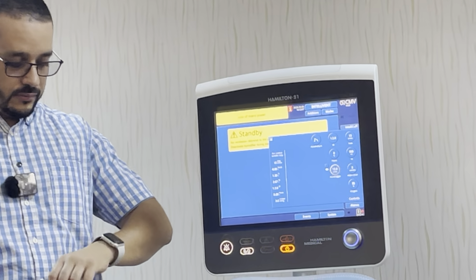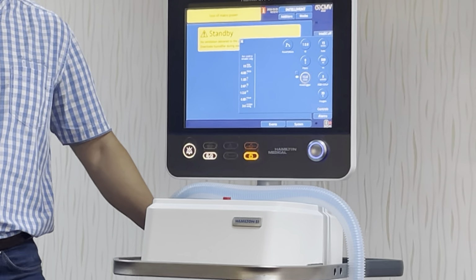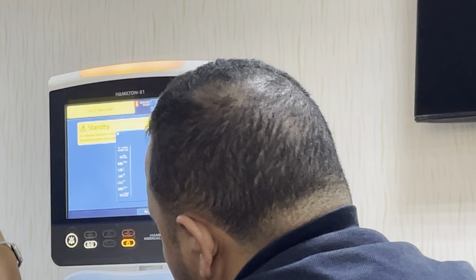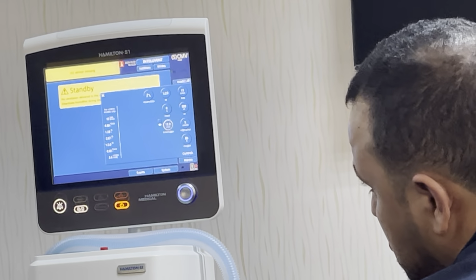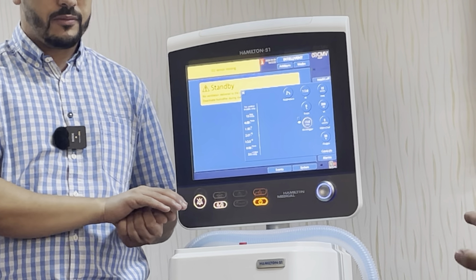Is it going to support the start of the breath, or will it let him take his breath and then support? Every time, the main reason of the support is to decrease the work of breathing. So there is no need to let the patient make a high effort in order to breathe. The machine will detect and support immediately with pressure or volume, and start the ventilation.